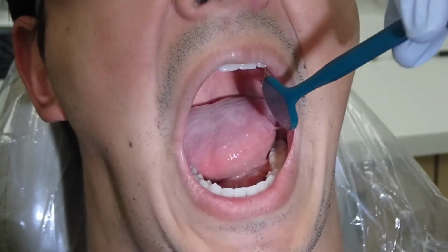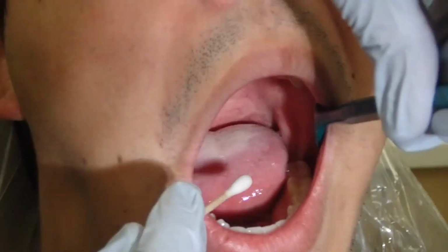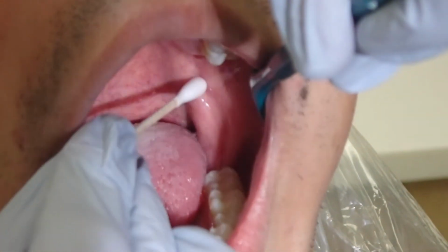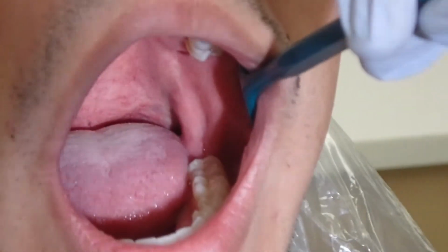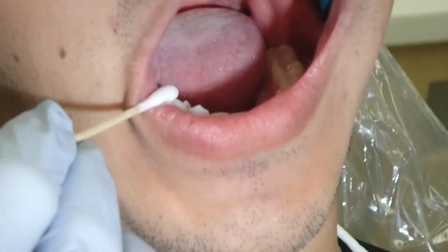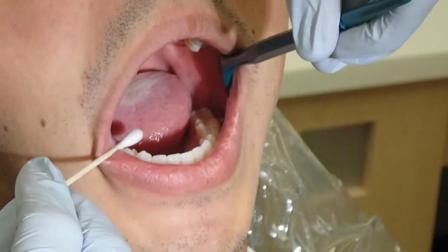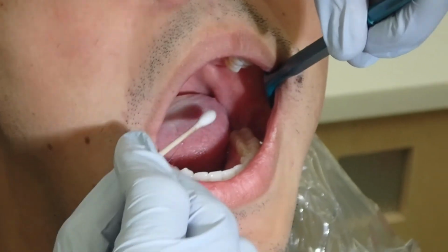There are several key anatomical landmarks for the IA. The first can be seen by asking the patient to open as wide as they can. This structure is known as the pterygomandibular raphe. The second set of landmarks are the contralateral first and second mandibular premolars. The premolars serve as a site through which you will direct your syringe and needle assembly toward the site of needle insertion.